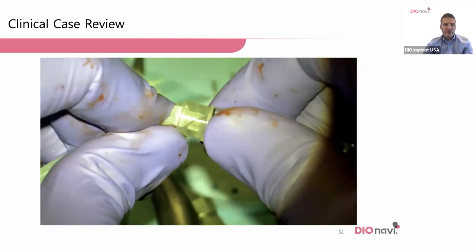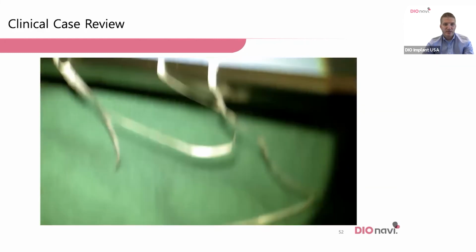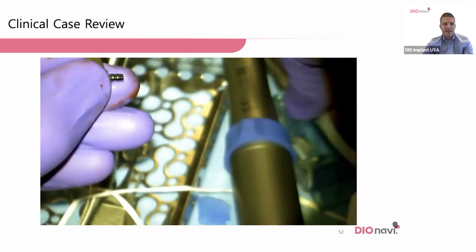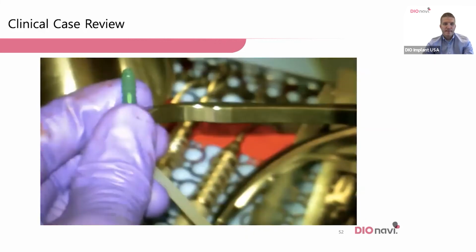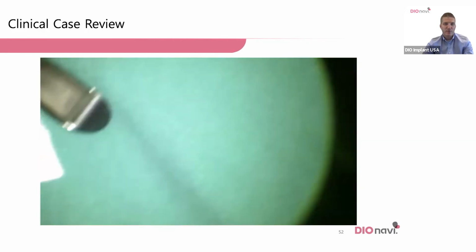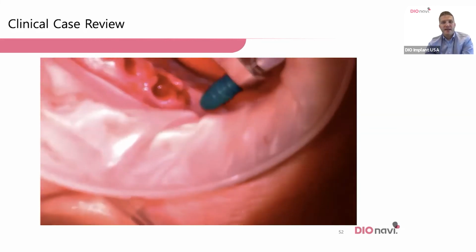I'm now securing the tubing to my sterile saline syringe. And then I'm going to grab the membrane lifter. I'm going to put the handle on it and then hook up the tubing. And just like you saw in that other video, I'm making sure I've got water primed on it. I've got to prime the pump. And then I'm going to seat this.